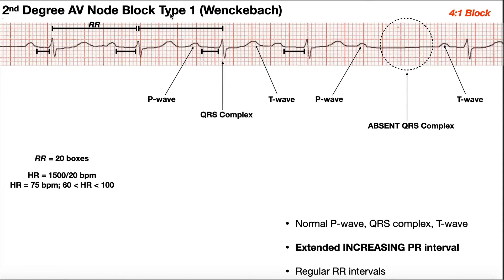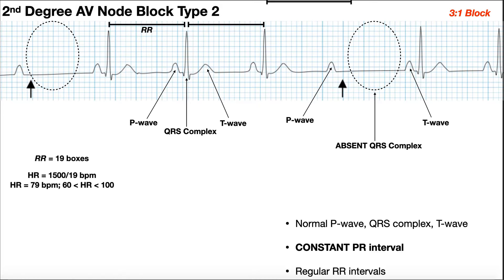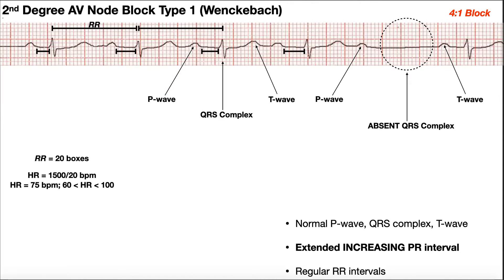Second degree AV node block has two types: type 1 and type 2. Notice in both, there are QRS complexes that are dropped. The type 1 second degree block still has normal P waves, normal QRS complexes where they're not dropped, and normal T waves. The interesting thing about a type 1 block is that the PR interval starts out elongated, but it actually starts to increase in length every successive cycle.